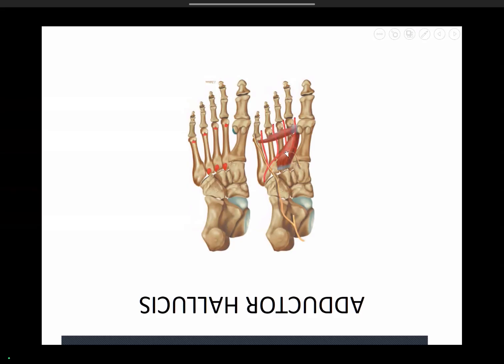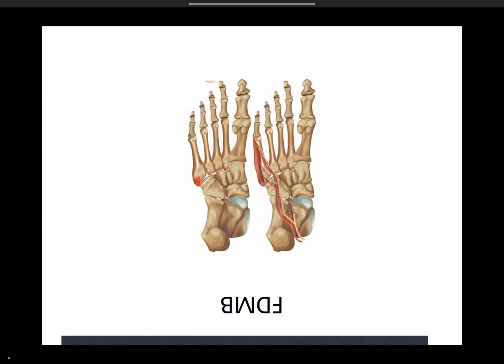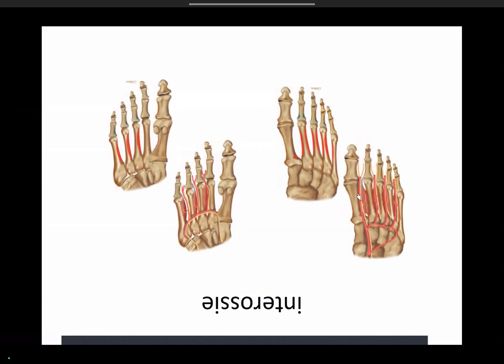The adductor hallucis has two heads and inserts on the lateral aspect of the first proximal phalanx. Flexor digiti minimi brevis inserts along the lateral aspect of the fifth proximal phalanx. Then the interossei — plantar and dorsal — the last layer of the sole of the foot. These are only notable when there is a stress fracture and edema within the fourth layer of the sole of the foot.